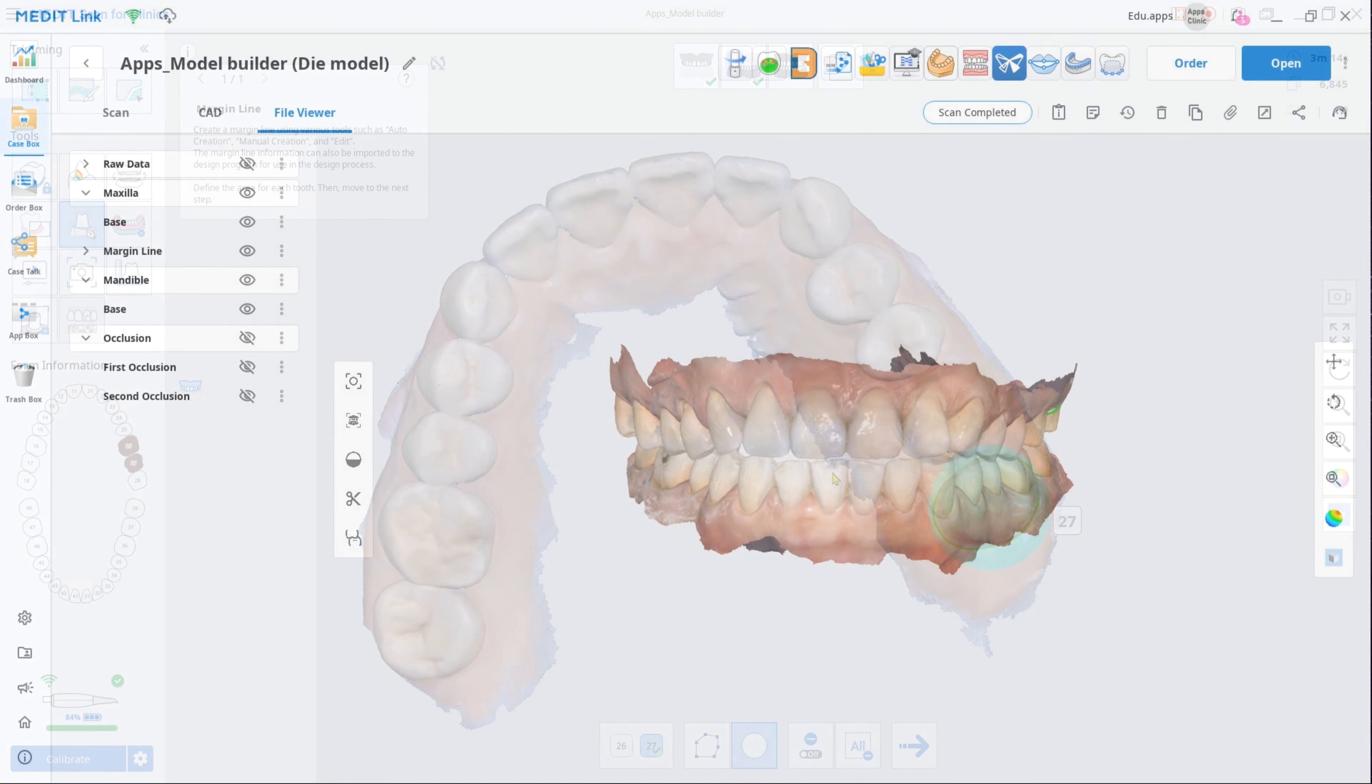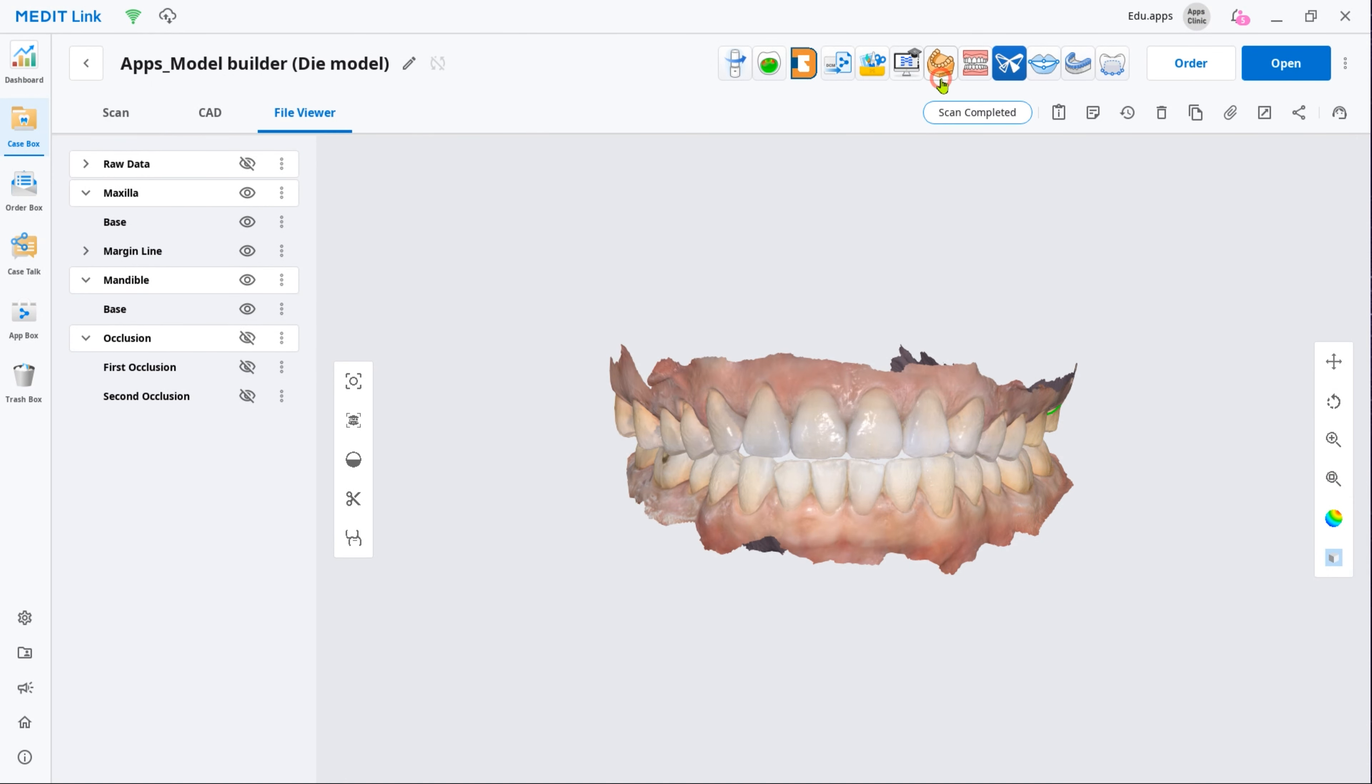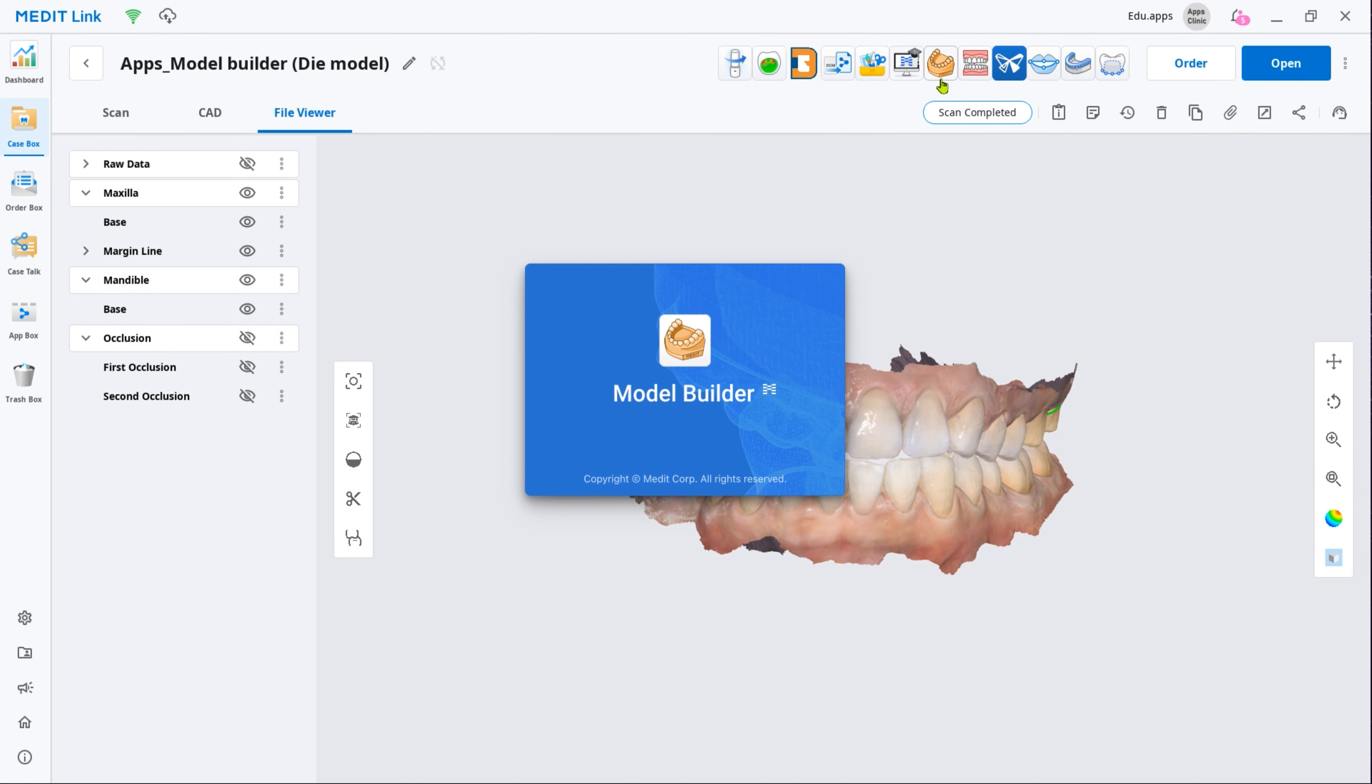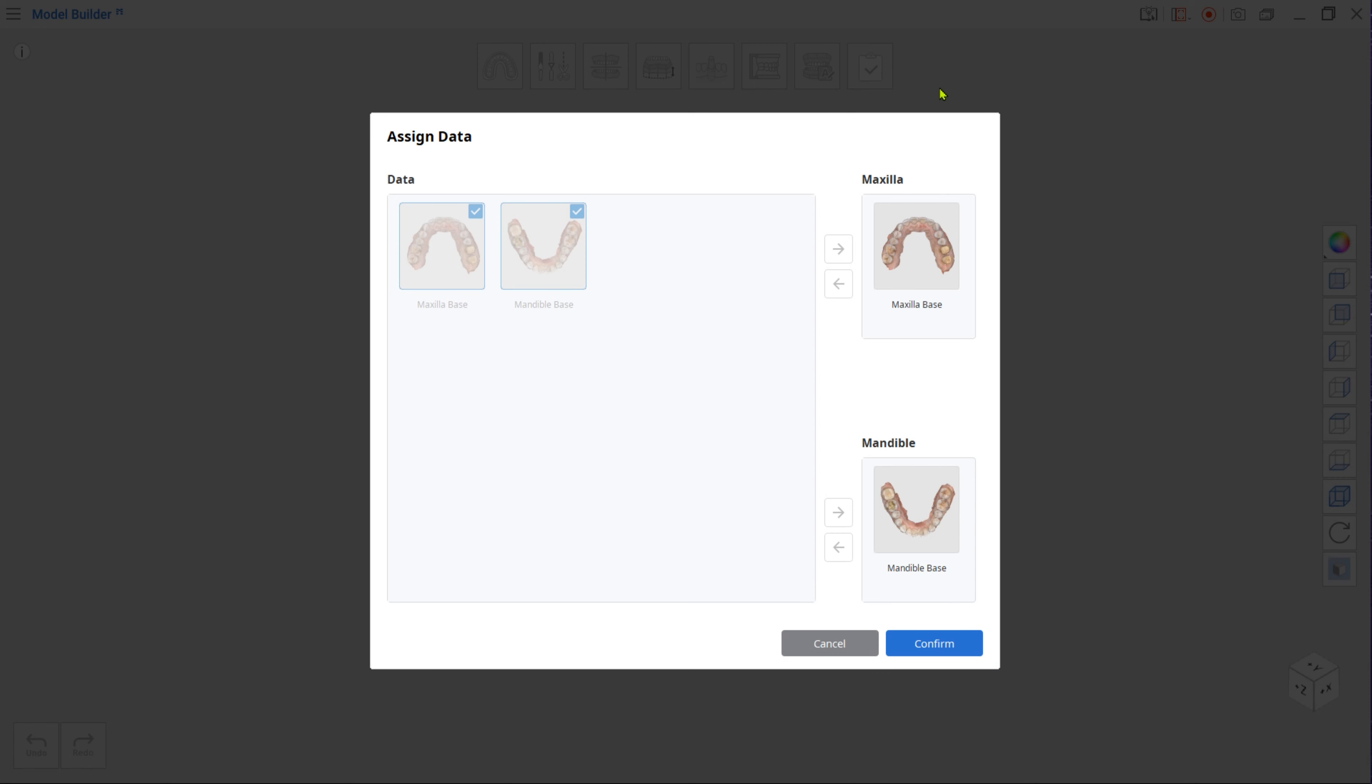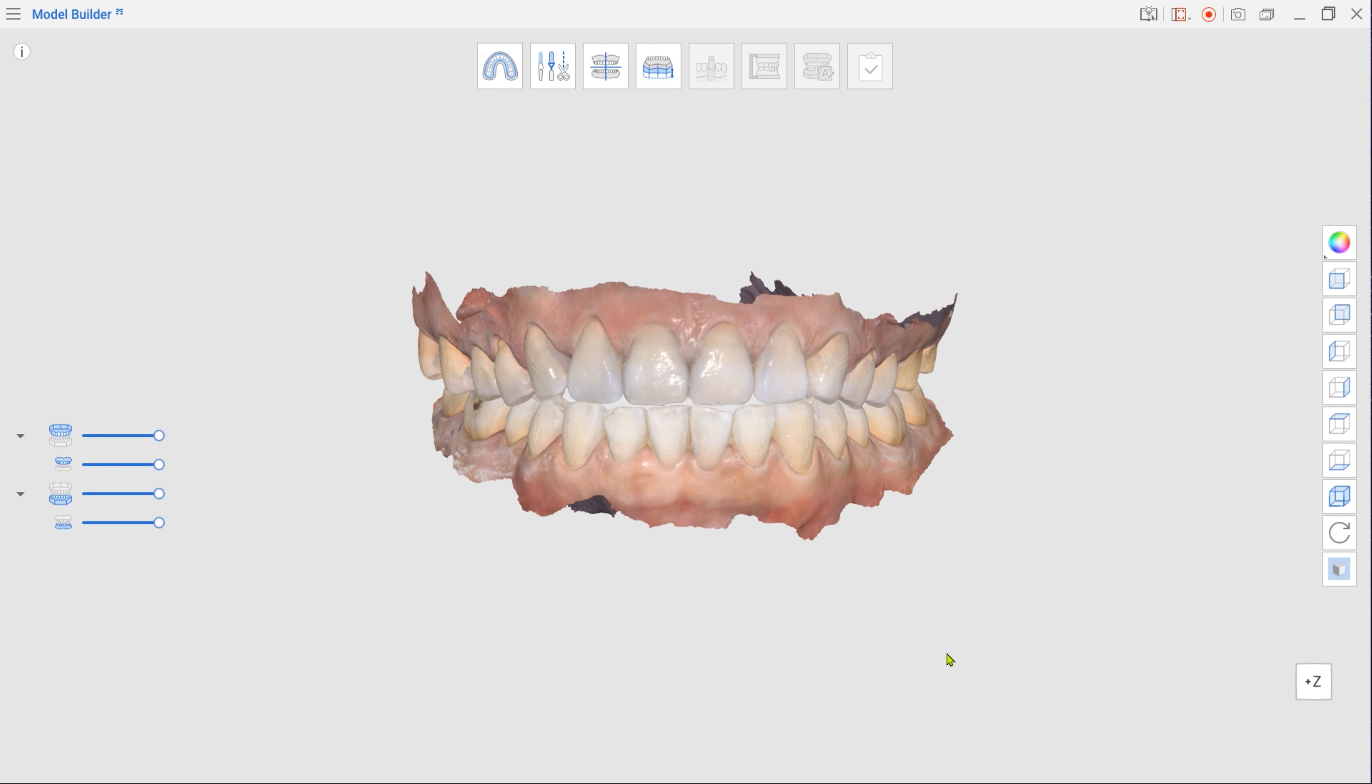After scanning, open Model Builder by clicking the app icon at the top. Your scan data will be automatically assigned as Maxilla and Mandible.